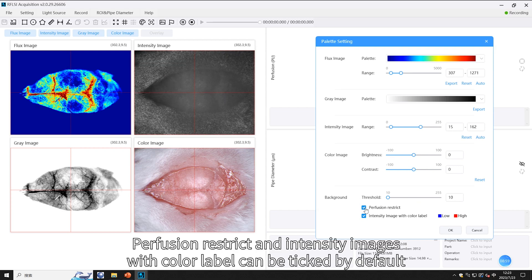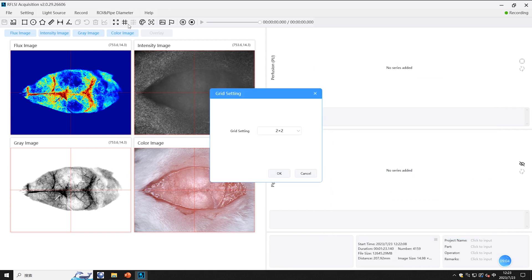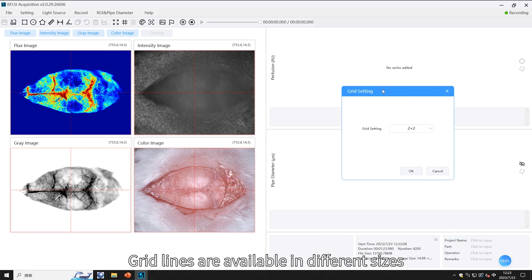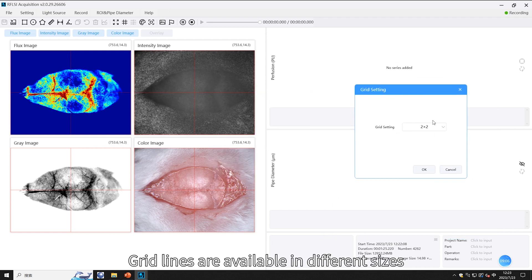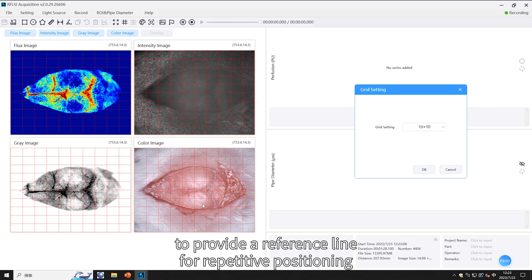In the palette, you can adjust the brightness and contrast of the color image; normally the default value can be used. Perfusion, restrict, and intensity images with color labels can be ticked by default. Grid lines are available in different sizes to provide a reference line for repetitive positioning.